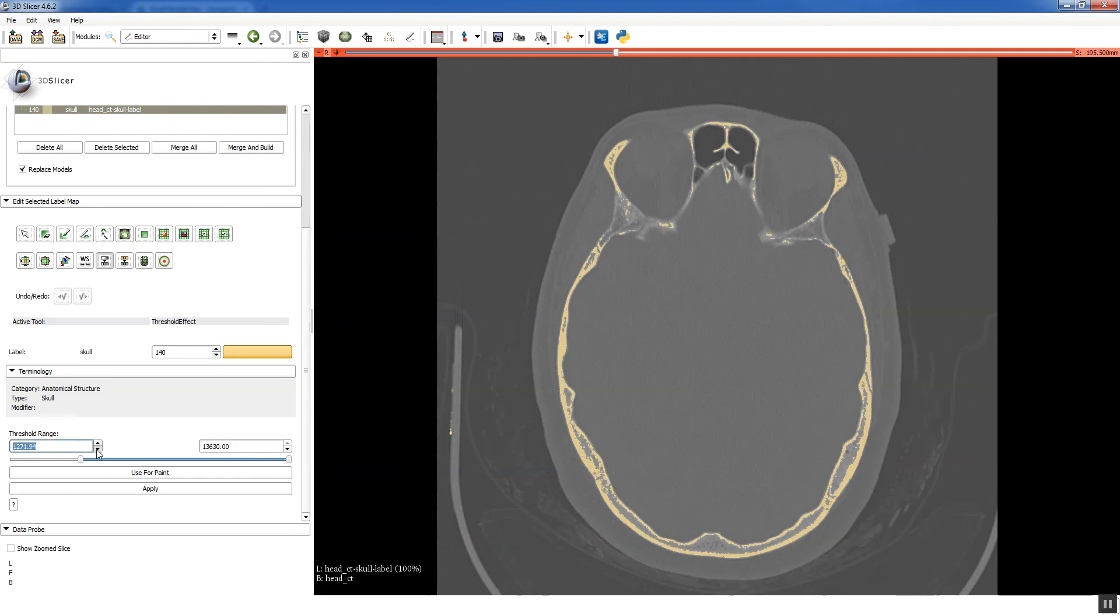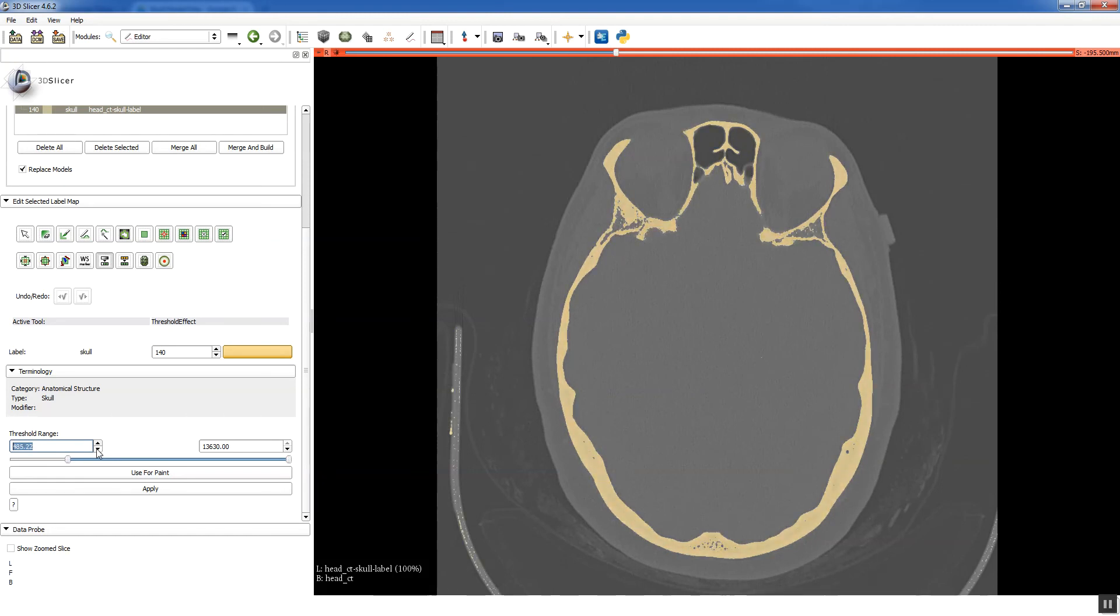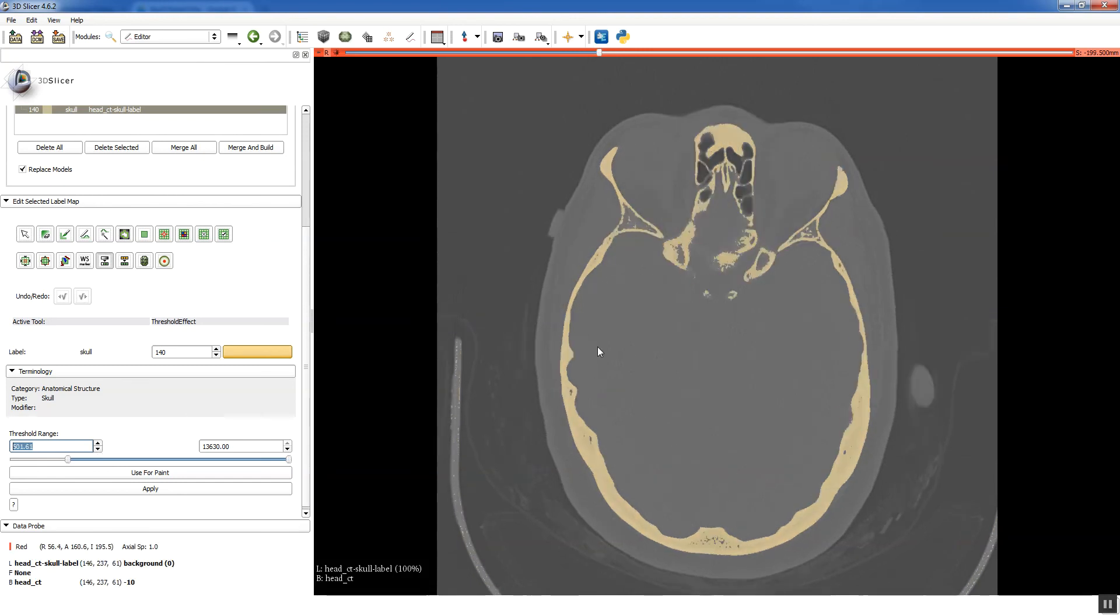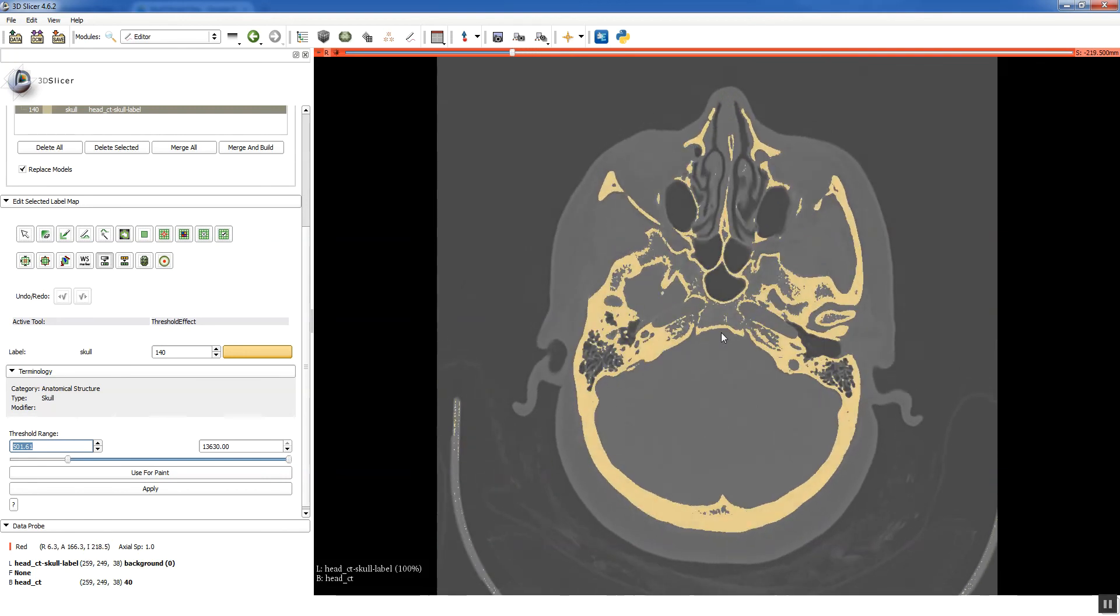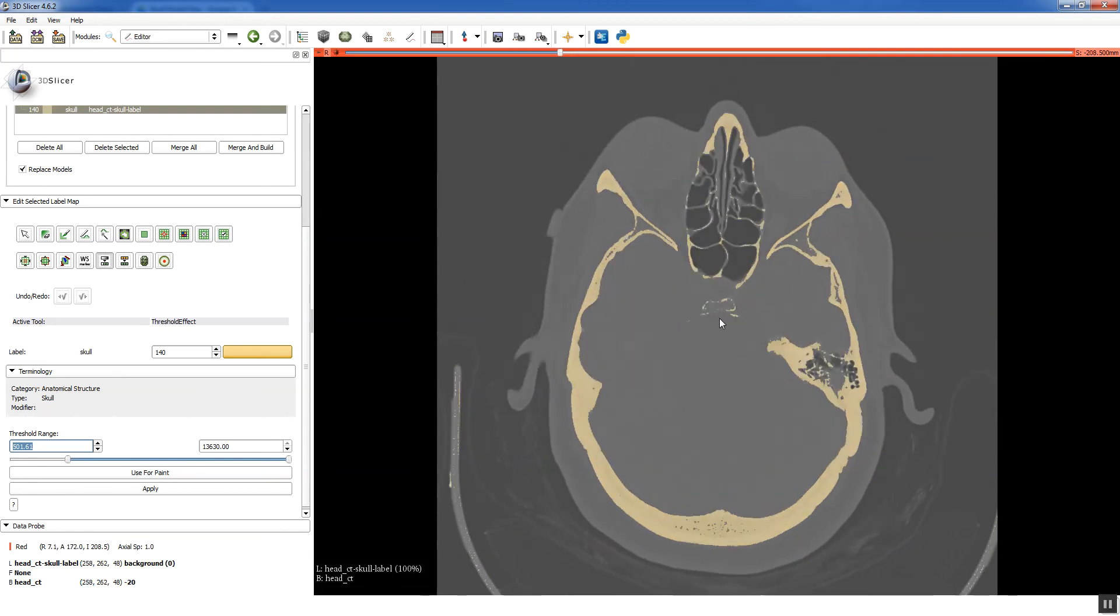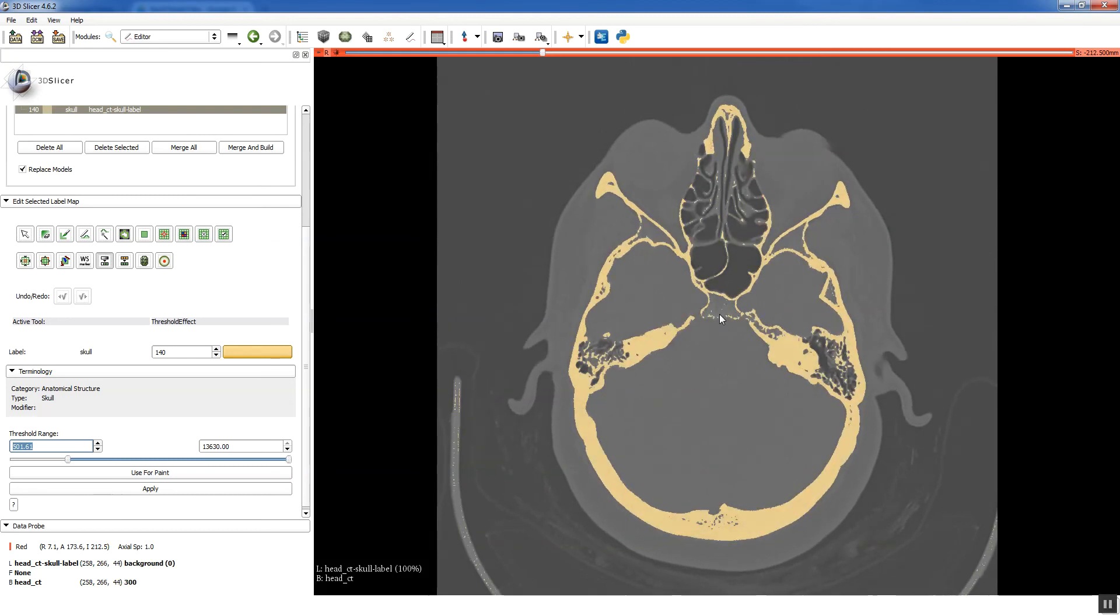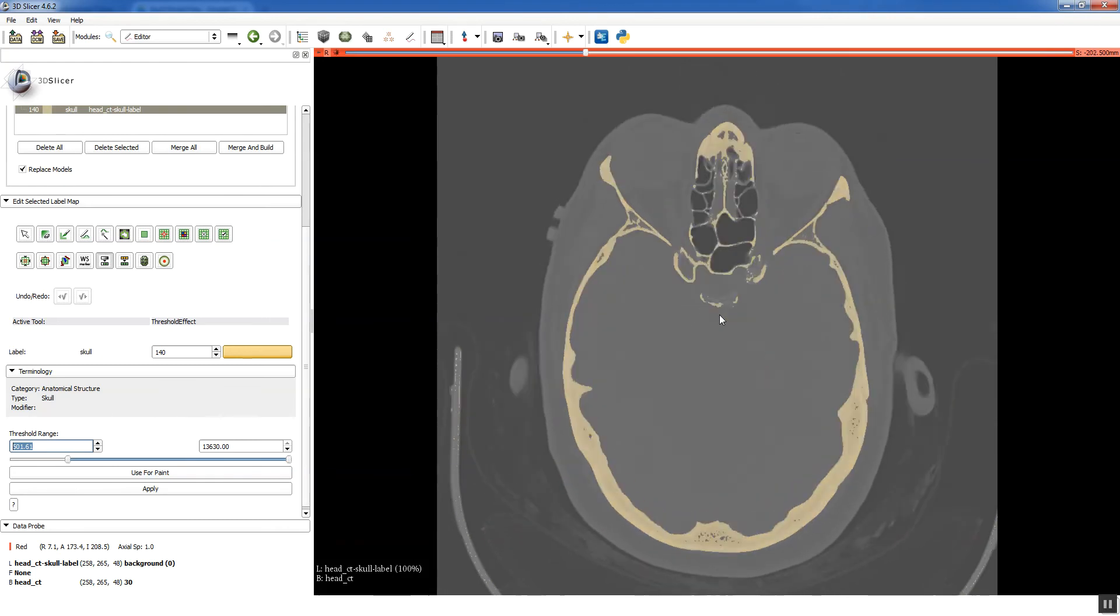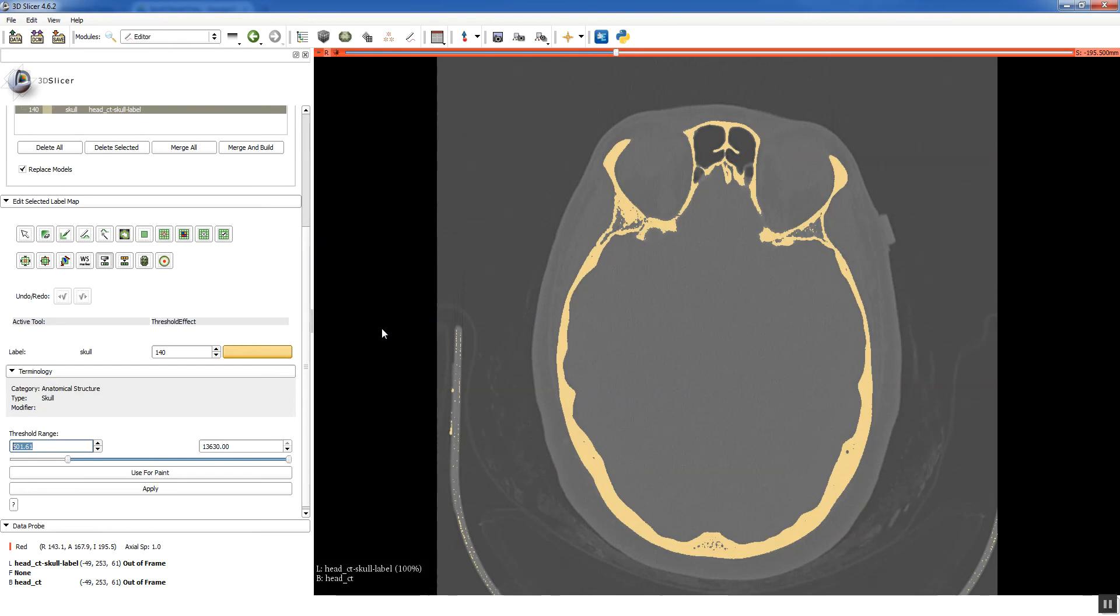So I'm going to bump the threshold down. And you can see that as we decrease the threshold values, more of the bone gets selected. So I'm just going to go until it seems like it has selected quite a bit. Now if I keep going down, you can see that it starts picking up noise, and we don't want that. So I'm going to go back to where it wasn't picking up much noise, but it was still getting most of the bone. It seems like a good happy medium. The clivus here still isn't very dense, so if we wanted a perfect model, we'd have to manually fill in some gaps there. But that's not exactly what we're going for here. So we'll call that good.